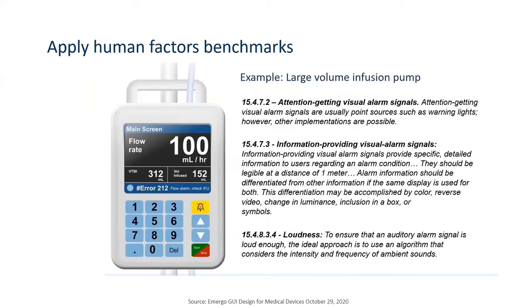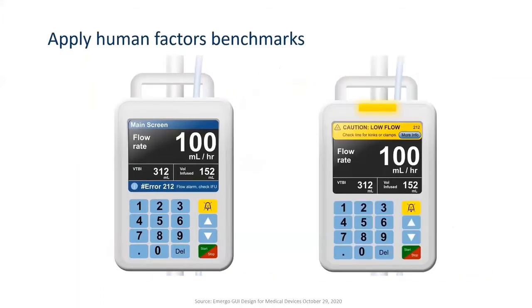Similarly, this is another, a large volume infusion pump. This is the before and the after when they were considering how to create user alerts and things.